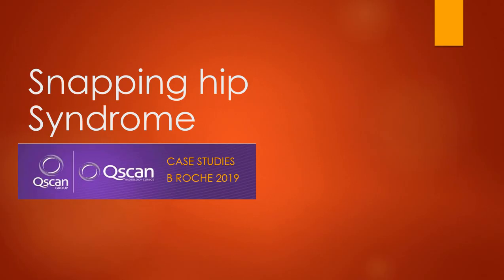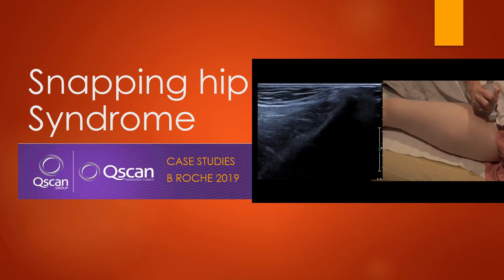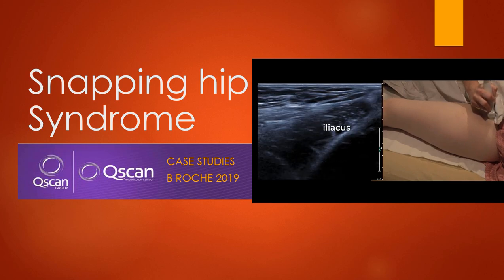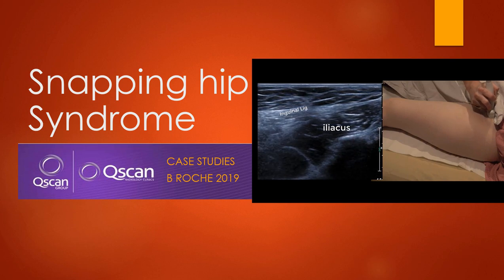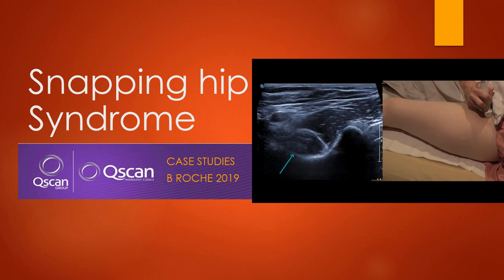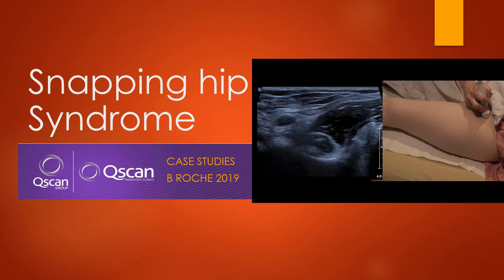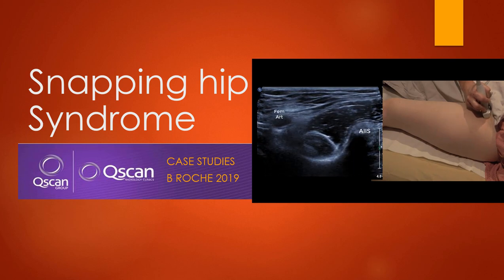So during routine hip ultrasound, at times there are patients who report a pain in the front of the hip or the side of the hip related to a clicking or a popping sensation or a giving way sensation. Sometimes they have soft tissue that's causing this sensation for the click outside the hip, and that's where we come in handy as sonographers. We can see all the soft tissues.